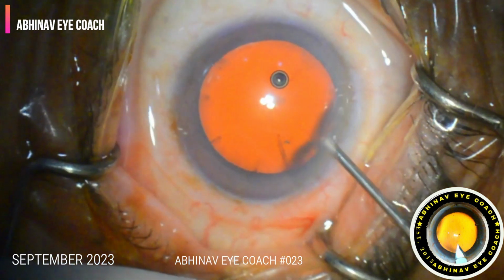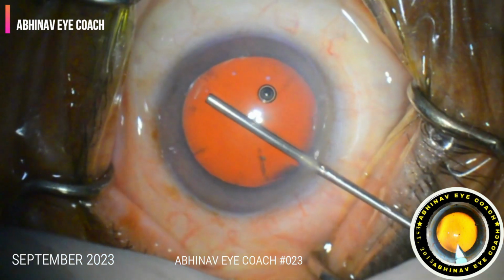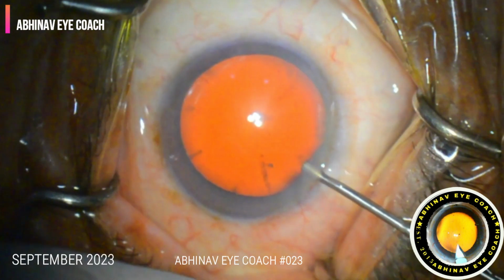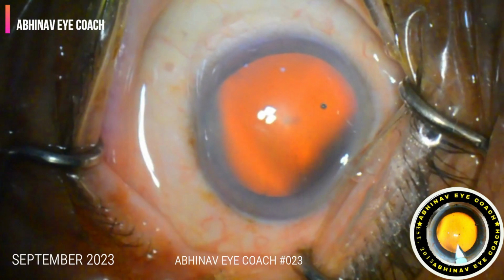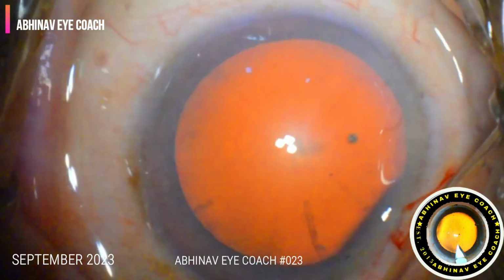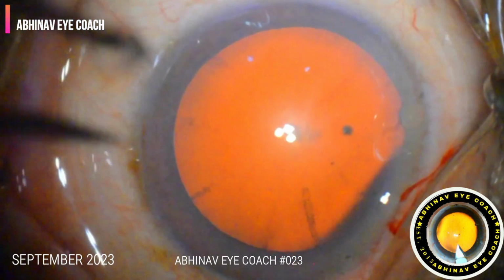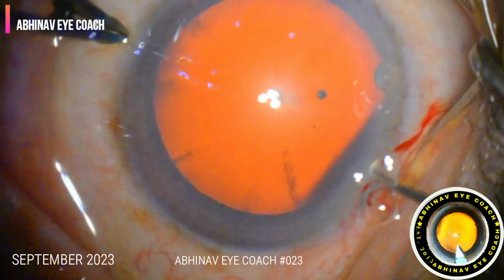here the anterior chamber is filled with the viscoelastic to coat the endothelium, and the cornea is covered with the viscoelastic. The globe is stabilized with the globe stabilizer and a 2.2 millimeter main port is made with the help of keratome.